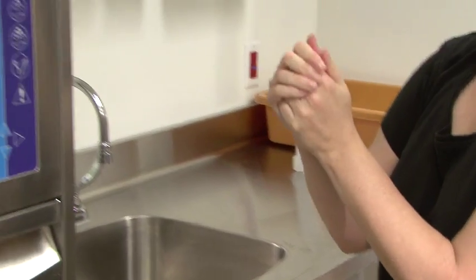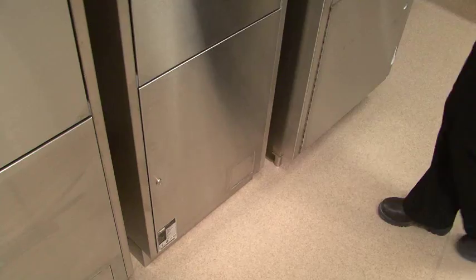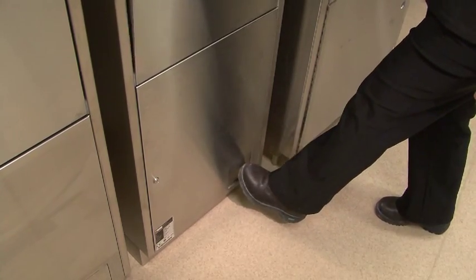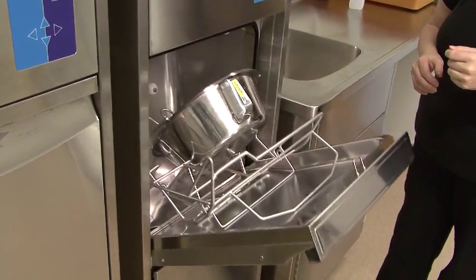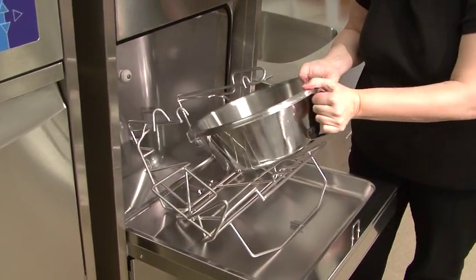When drying is complete, open the door with either the infrared no-touch sensor or the foot pedal. The voiding devices are disinfected and dry and can be removed without wearing gloves.